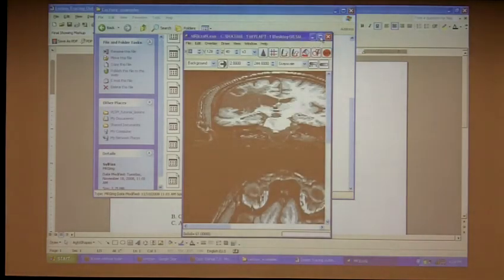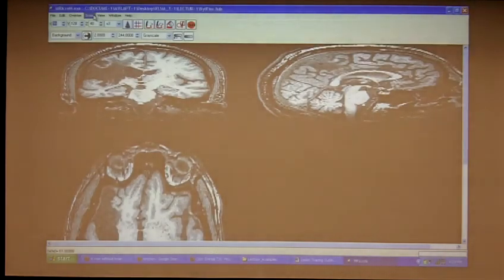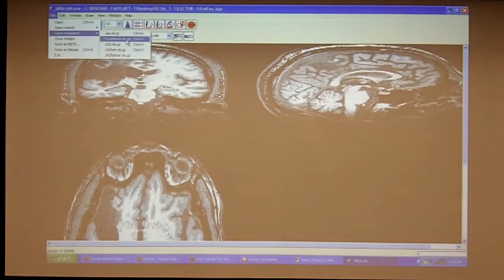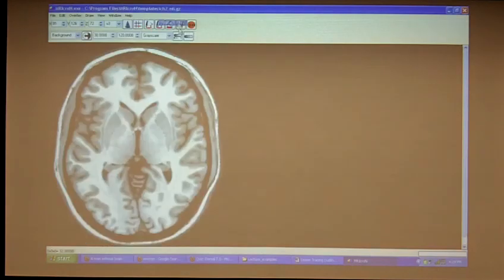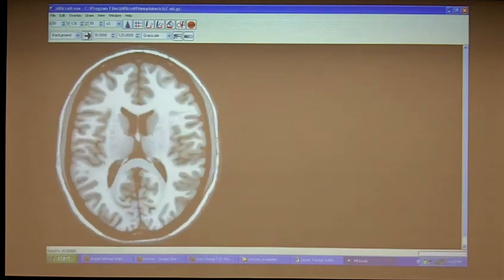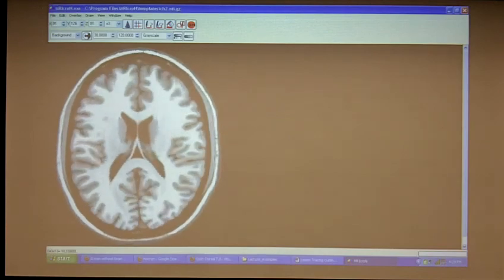can be problematic. And actually, I'm going to show you this on the template. So these things are normal, axial. Okay, so you see all these parts that sort of duck in here, right? And then you have something like this over here, right? You're like, well, that's weird. It's kind of in the middle of the brain. It's kind of surrounded by tissue, but it's a big hole. What's that about? Well, it's a normal sulcus. It's just a horizontal cut through it.